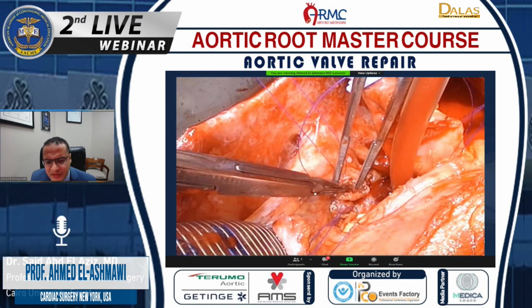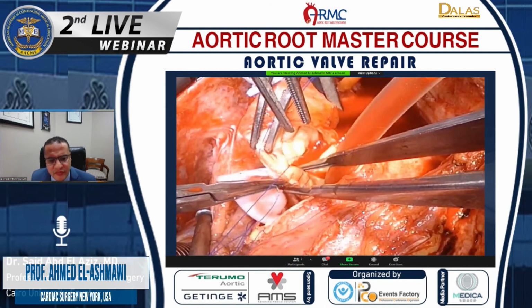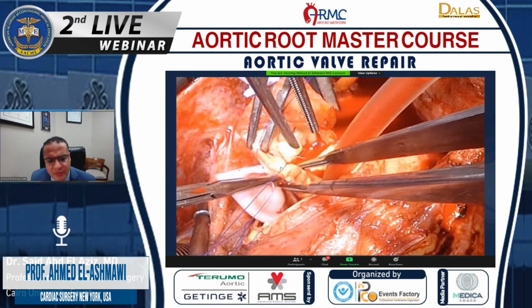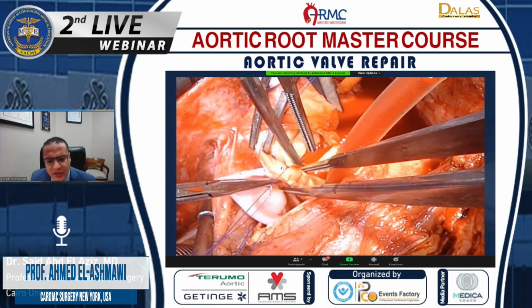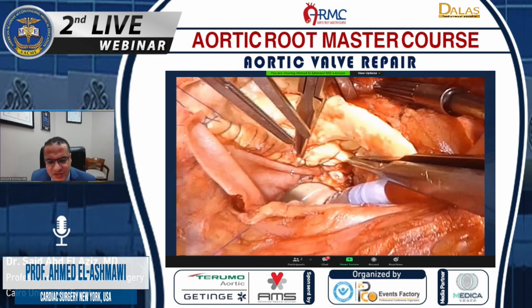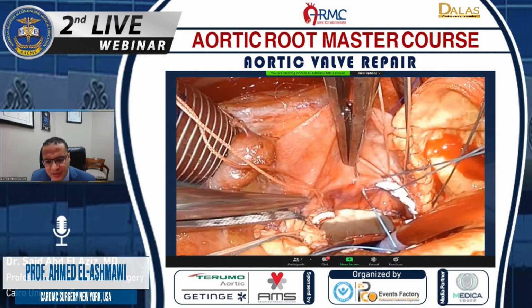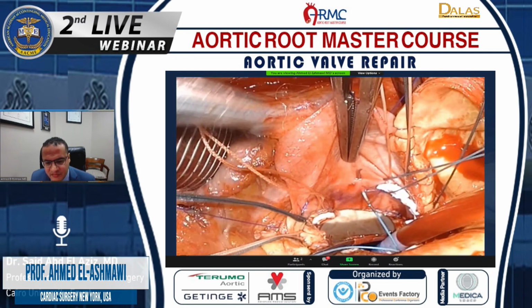So now we're done with the mitral valve replacement and reconstruction of the dome of the atrium. Now it became sort of a root enlargement. The patch is taken out up to the edges of the aortotomy, and we have a very voluminous, big aortic root. The original valve size before we did the enlargement was 23. Now we can implant a 27 Magna valve.